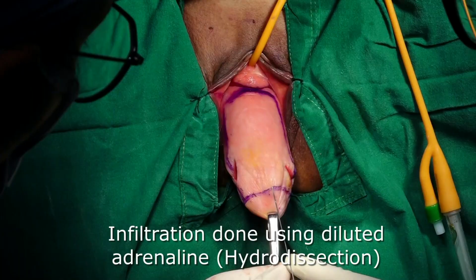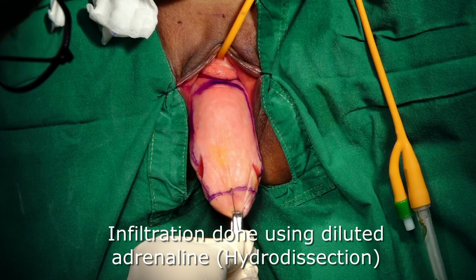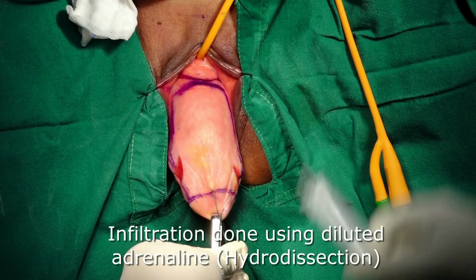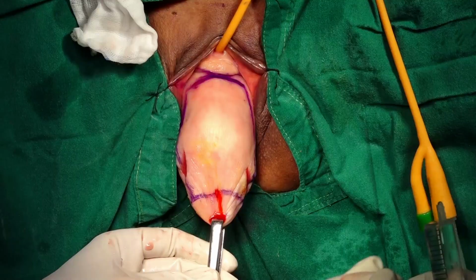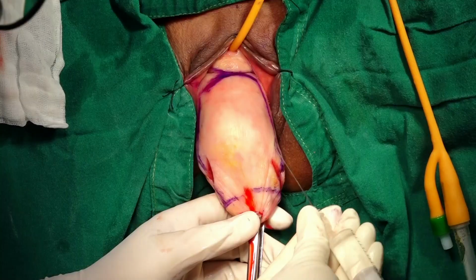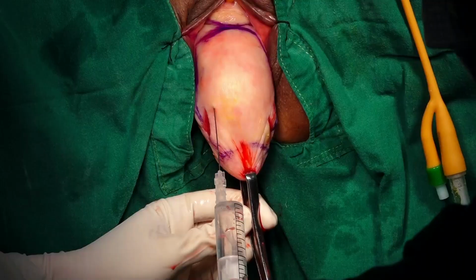The planes are then hydrodissected using diluted adrenaline. As mentioned in our previous videos, the needle has to be maintained at an angle of 0 to 15 degrees. The anterior vaginal epithelium can be seen being raised. Good hydrodissection is always a good start to the surgery.